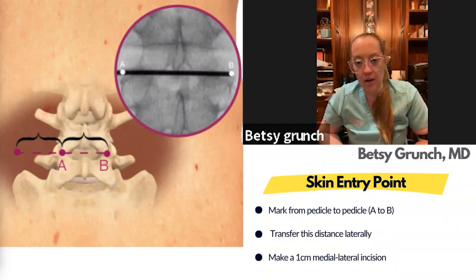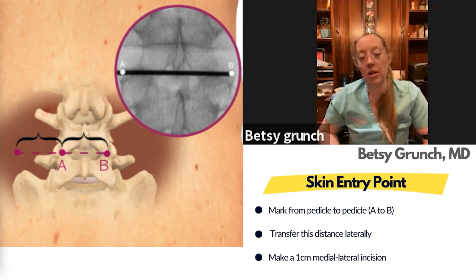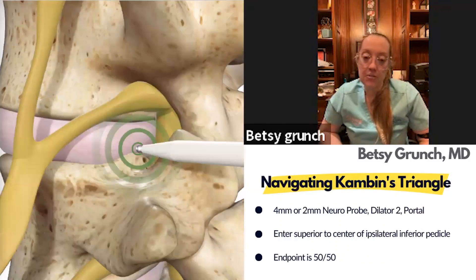The training tools say to measure pedicle to pedicle and then go that same length off midline. Honestly, it ends up being about eight centimeters off midline almost every time, so I go eight to ten centimeters off midline depending on body habitus — the bigger the patient, usually a little bit more lateral. That will be your incision and entry point.